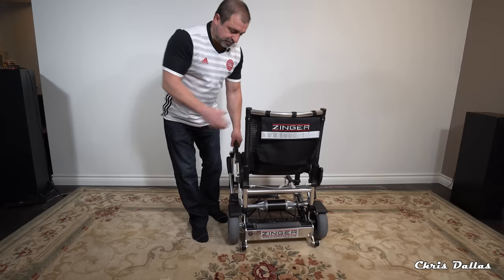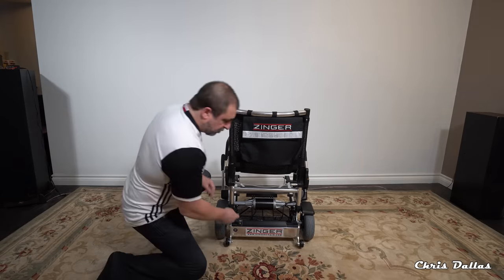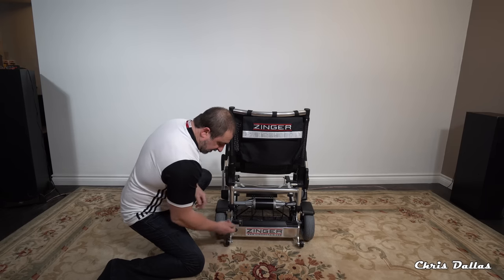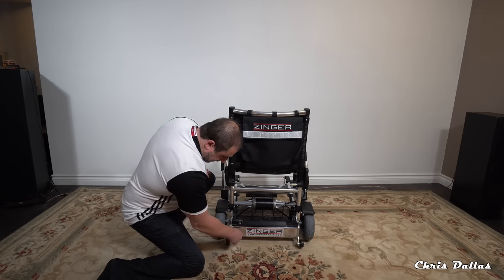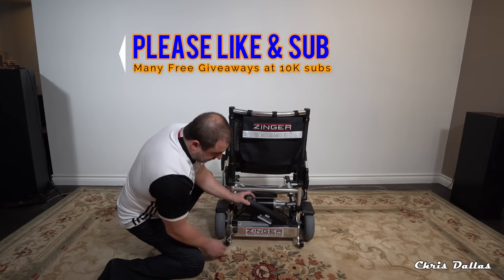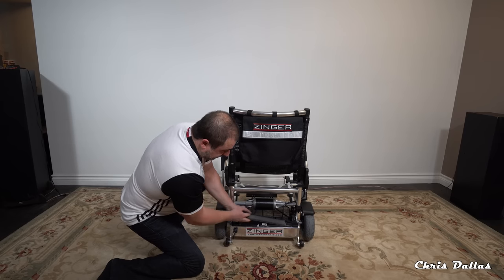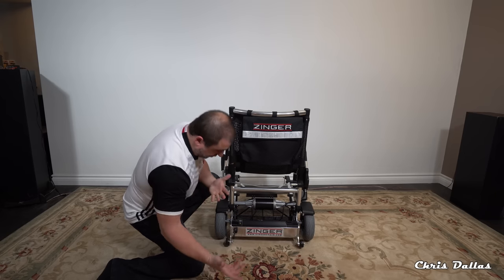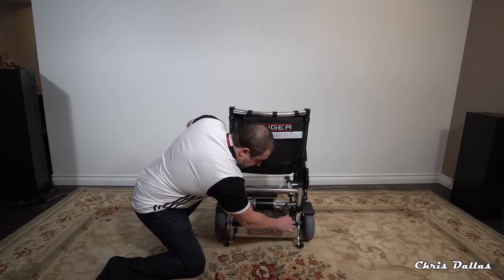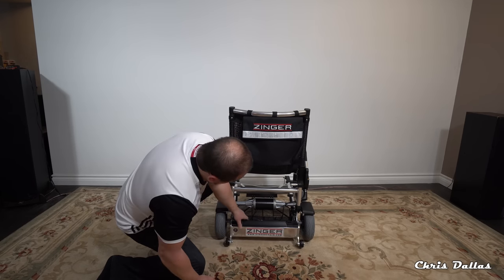At the back of the chair you can see the battery at the bottom. You can replace this battery — it's safe and nobody can steal it unless they have the key. To unlock it, just turn it and the battery comes right off. Take it with you to charge, or just leave it in the chair. Here's the charging port — you can charge the battery without removing it from the chair.